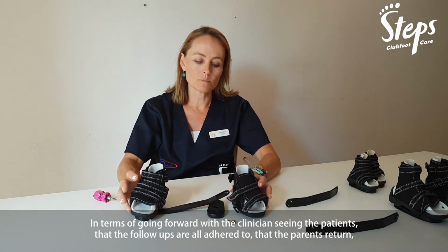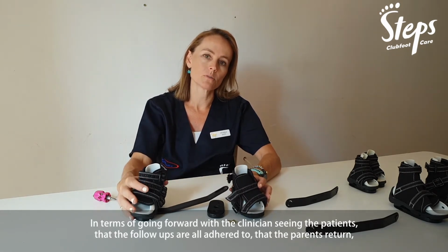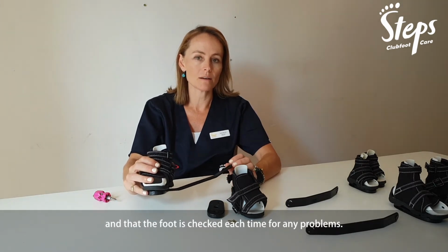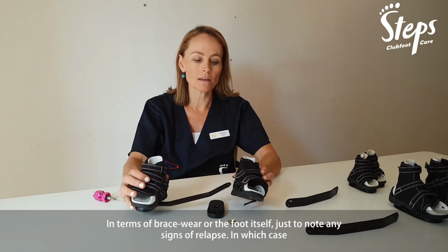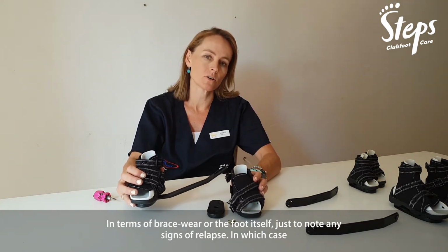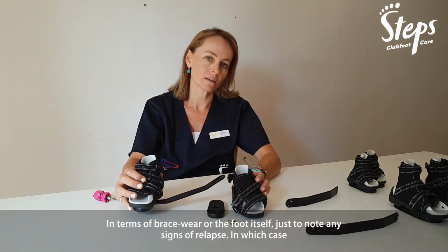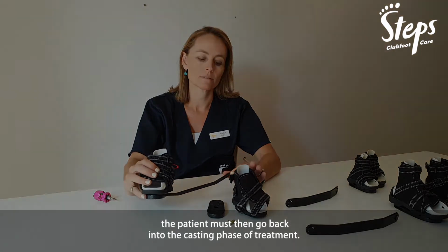And in terms of going forwards with the clinician seeing the patients, the follow-ups must all be adhered to and the parents must return, and the foot is checked each time for any problems in terms of brace wear or the foot itself. Note any signs of relapse, in which case the patient must then go back into the casting phase of treatment.